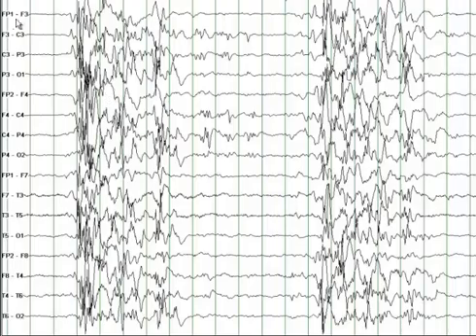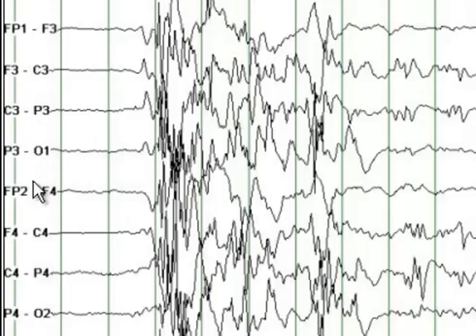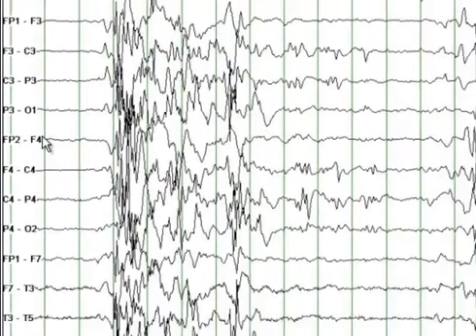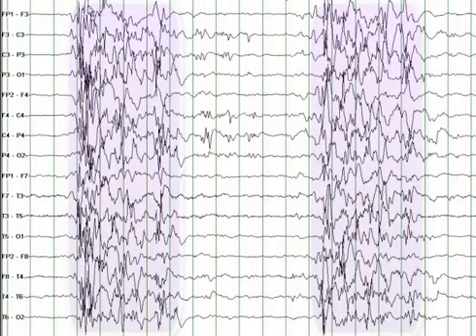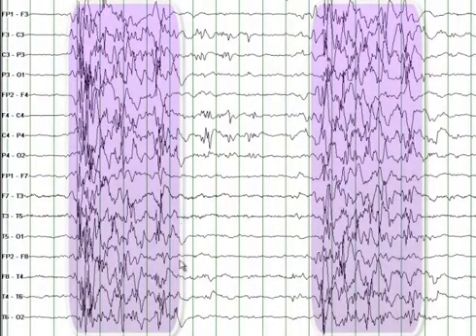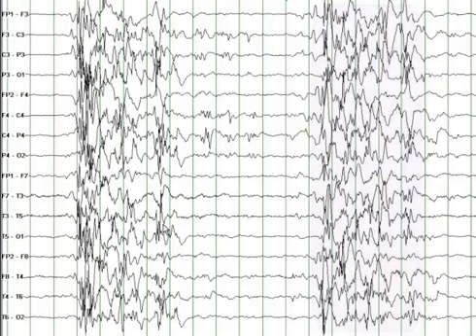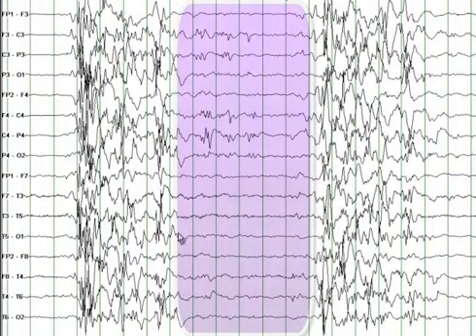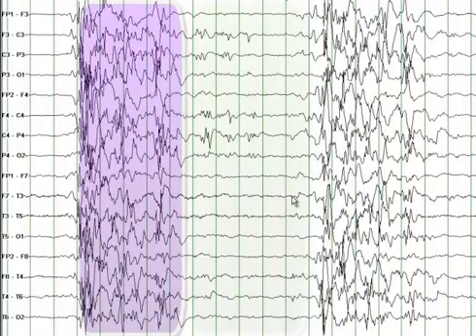Let's start with a quick orientation. On the left side you see all the odd numbers in the first four channels — odd numbers record from the left side of the brain and the even numbers record from the right side of the brain. On this EEG there are a few things that are quite noticeable. You see these generalized bursts of delta and theta activity intermixed with sharp waves and spikes that last for approximately four seconds, and then a period of low amplitude suppressed activity that lasts for approximately six seconds.